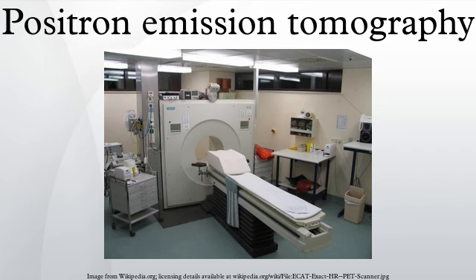activity of each parcel of tissue along many LORs can be solved by a number of techniques, and, thus, a map of radioactivities as a function of location for parcels or bits of tissue can be constructed and plotted. The resulting map shows the tissues in which the molecular tracer has become concentrated, and can be interpreted by a nuclear medicine physician or radiologist in the context of the patient's diagnosis and treatment plan.